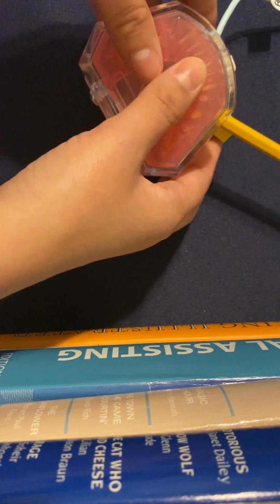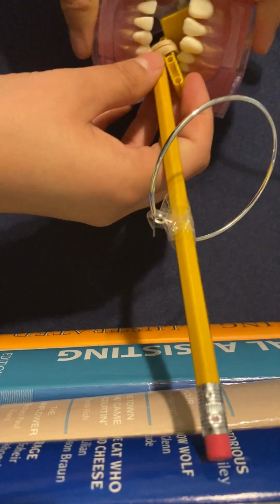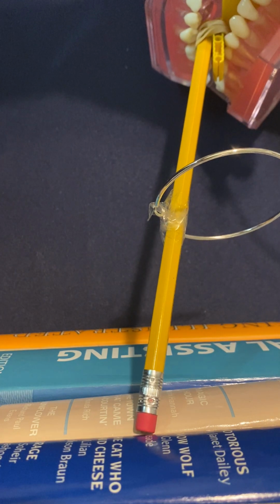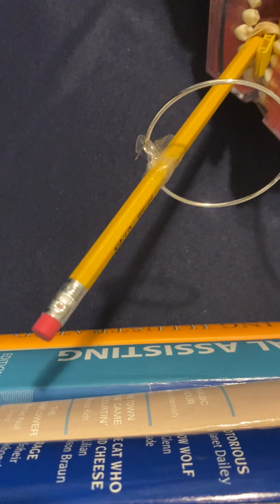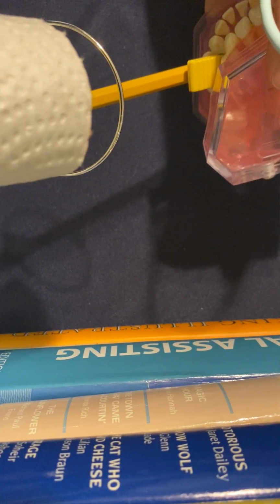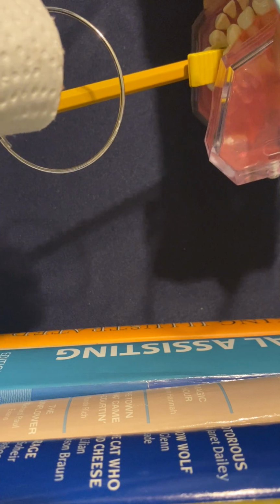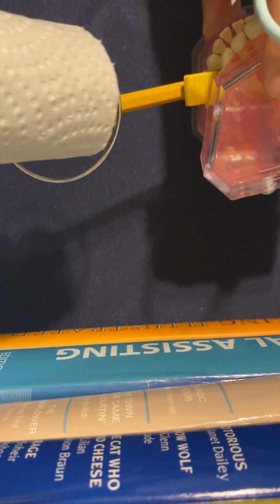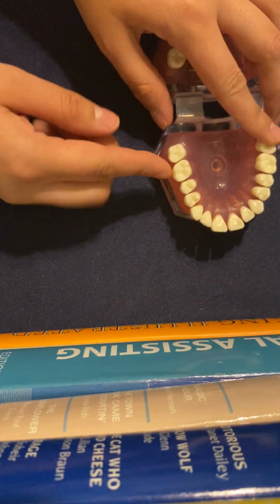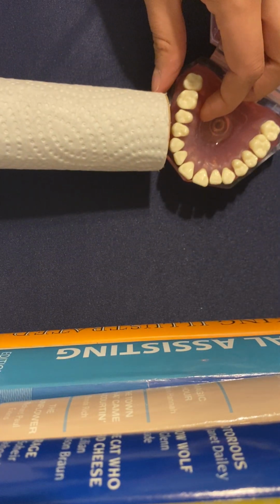And the point of these shots, I'll explain in a minute. And you want to point your central ray from the pupil to the mid-cheek area. So here's his nose, here's kind of his cheek area. Oh, sorry about that. Point like that so that it lines up. But like I think I said in an earlier video, if you line it up with the teeth, you want to line it up as straight with that tooth as possible.